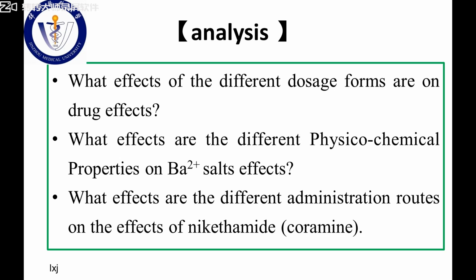So maybe the volume of the drug solution is not accurate. So finally, the drug administered to the animals is not correct, and it may be a wrong result. And sometimes it can also be caused by the animals. Don't forget individual variation from individual factors.